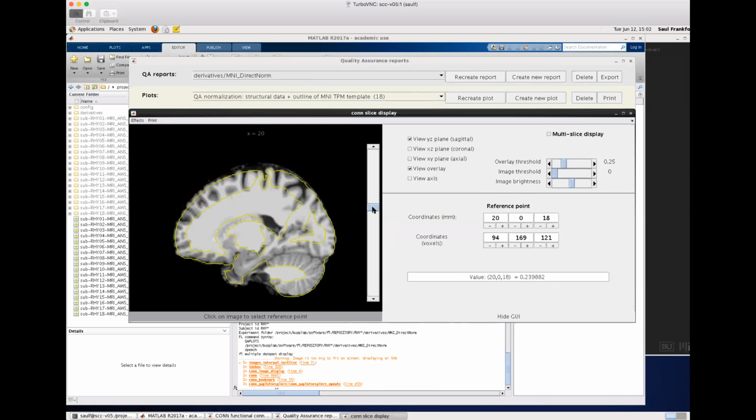For example, now that we are getting to surface-based analysis, I want to make sure that we have the best possible preprocessing procedure for it. I do care about the quality of this normalization, just because it's one of the potential alternatives to generating the surface analysis based on normalized data instead of on the raw data. So for that type of question, then yes, you definitely want to look in more detail and figure out where it's failing and why and see how you can make it better.